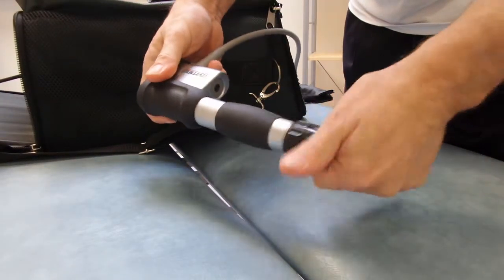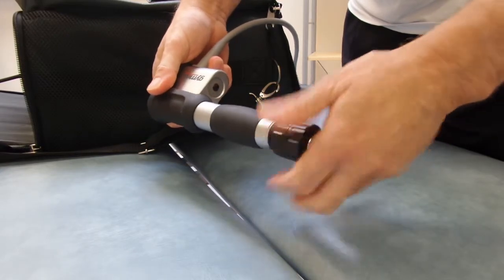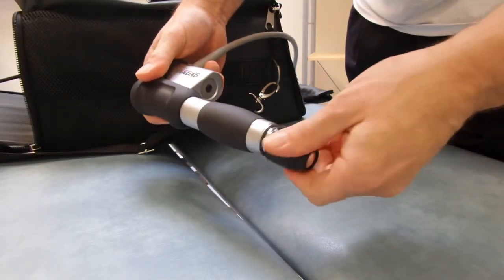Today we'll be treating the hand again. We've done this treatment previously with the Enraf 811. Today we'll be doing it with the Gymna Shopmaster 300.